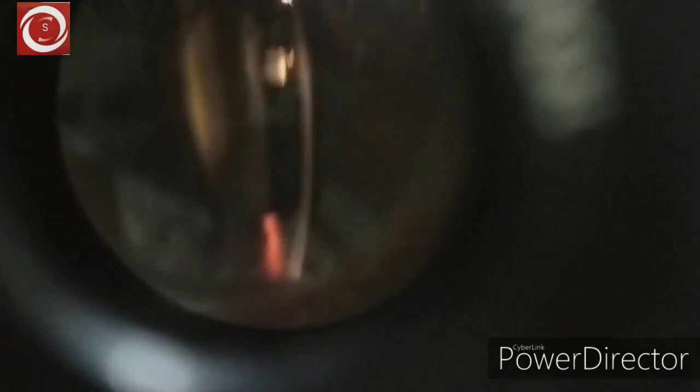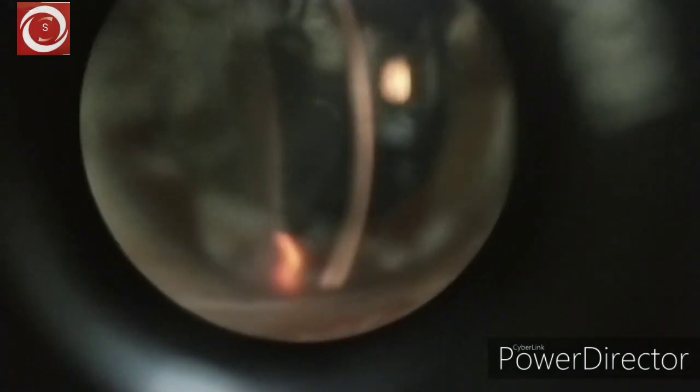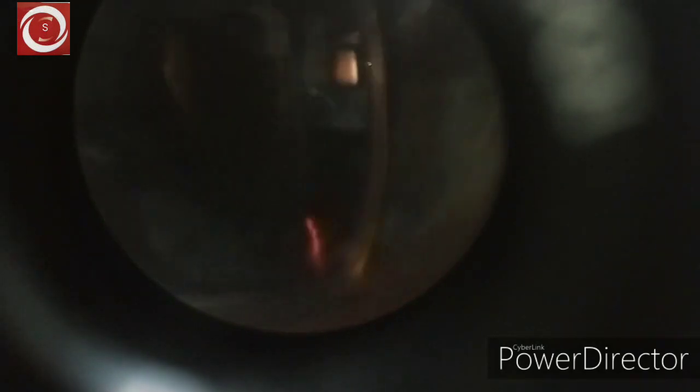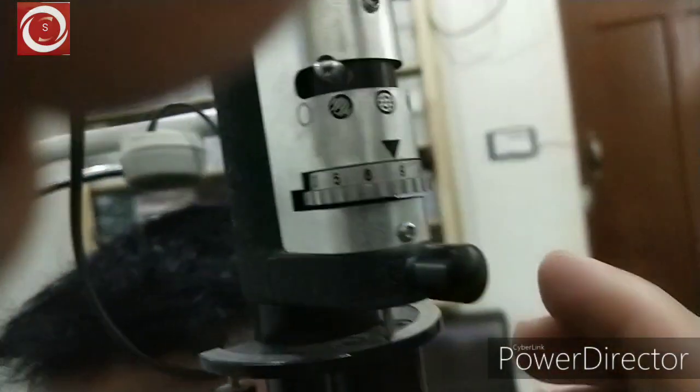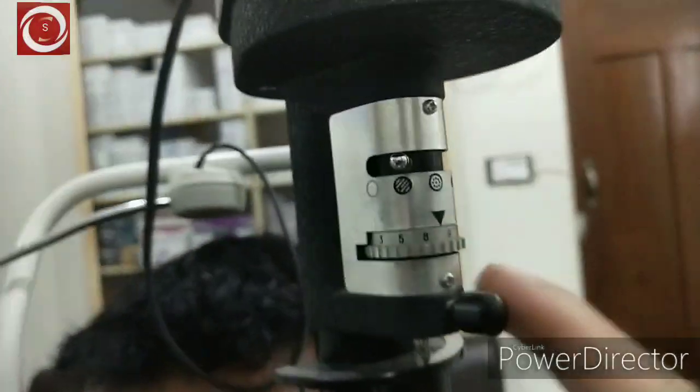Now it's a magnified view and we can check the cornea. That's the corneal slit — we are checking the cornea. Cornea is almost normal on oblique illumination. The button for the length should be at full 9, which is the maximum, and that's the button for the width — that's how you see pathologies in the anterior chamber.